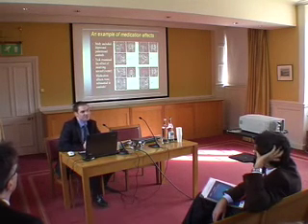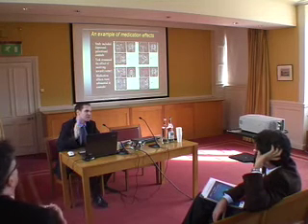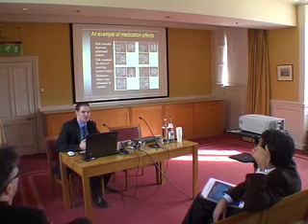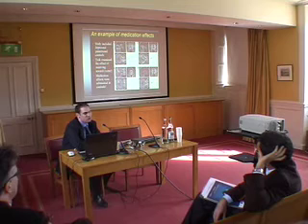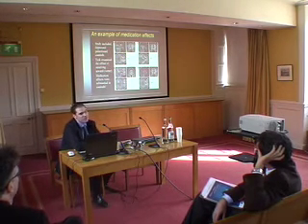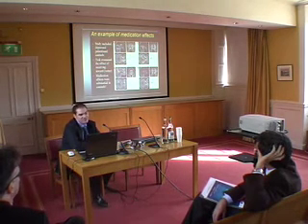So here's an example of medication effects, a great study by Kumar et al. in Brain from last year, and they were actually trying to look at the effect directly of antidepressants. So this is patients with major depression, and you can see the top left picture is the control sample, and the top right picture, C, is the patient sample. And you can see there's this area that I've circled in red, which is the anterior cingulate cortex, and you can see that effect is absent in the patients relative to the controls.